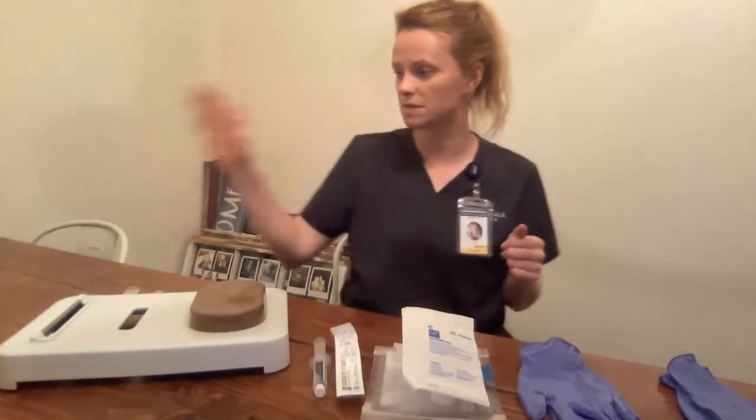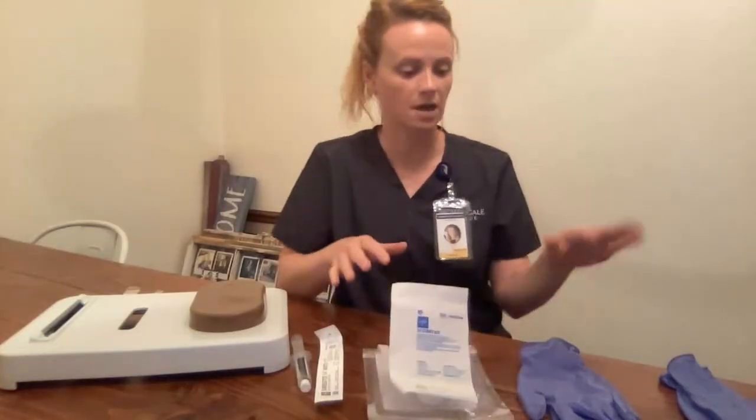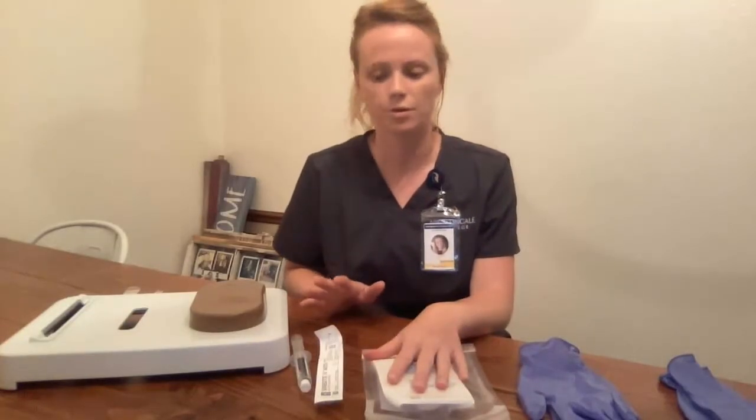My supplies for this video: Mrs. Smith here, her forearm. I have saline, the IV needle, IV start kit, extension tubing, and two pairs of gloves. Obviously, all these supplies have been manipulated due to practice purposes.